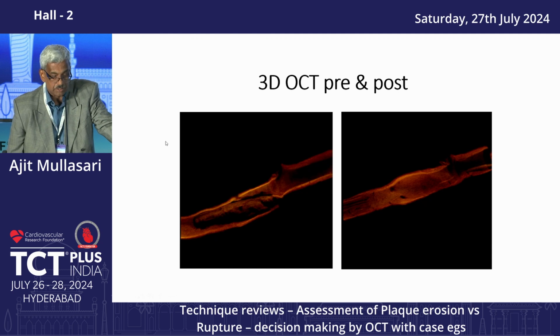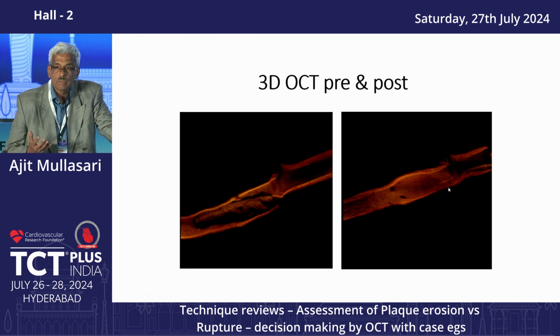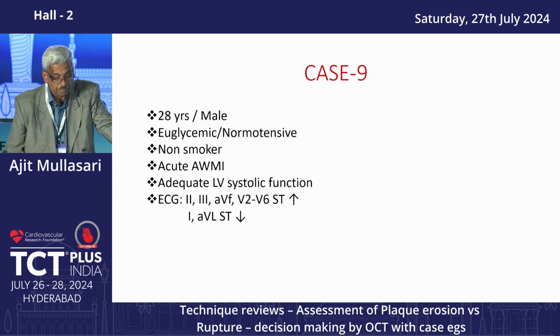And this is a 3D reconstruction of that OCT. You can see the large thrombus before and after everything is cleared with medical therapy. So clearly what this is showing is that there's a group of patients who have erosions who can be left very safely alone on medical treatment.